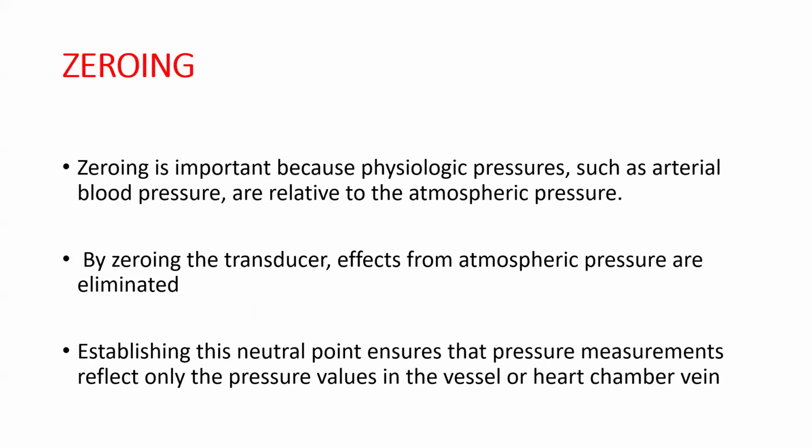Zeroing is important because physiological pressures such as arterial blood pressure are relative to atmospheric pressure. By zeroing the transducer, the effect of atmospheric pressure is eliminated. Establishing this neutral point ensures that pressure measurements reflect only the pressure value in the vessels and heart chamber.